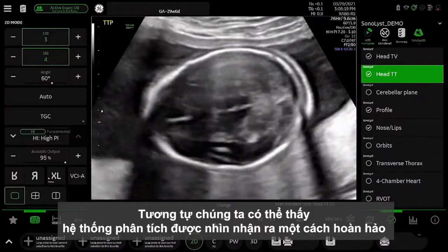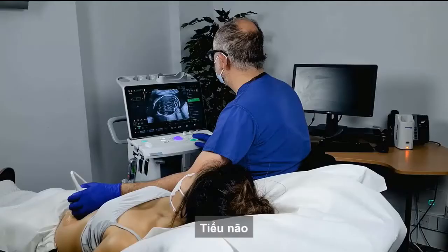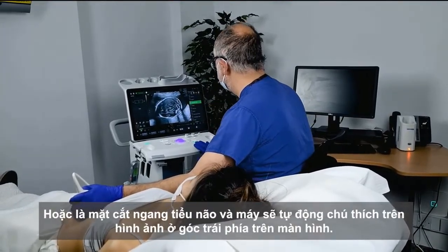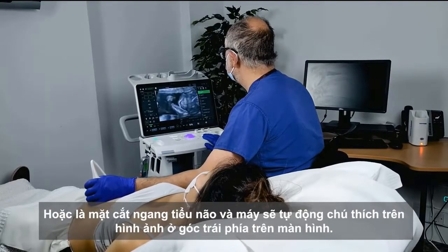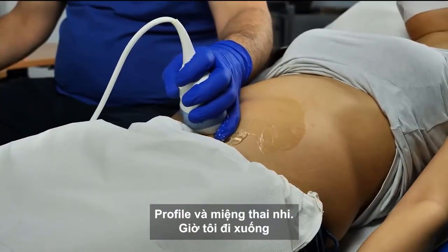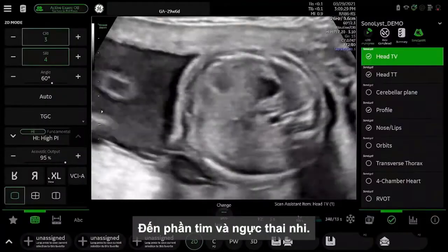So we can see beautifully there the cerebellum. And again, the system recognizing this as a cerebellar plane, or the transcerebellar plane, as in that little logo up there. So this is the head. We've seen the profile already and the lips. We come down the baby, coming down here to the heart and the chest.